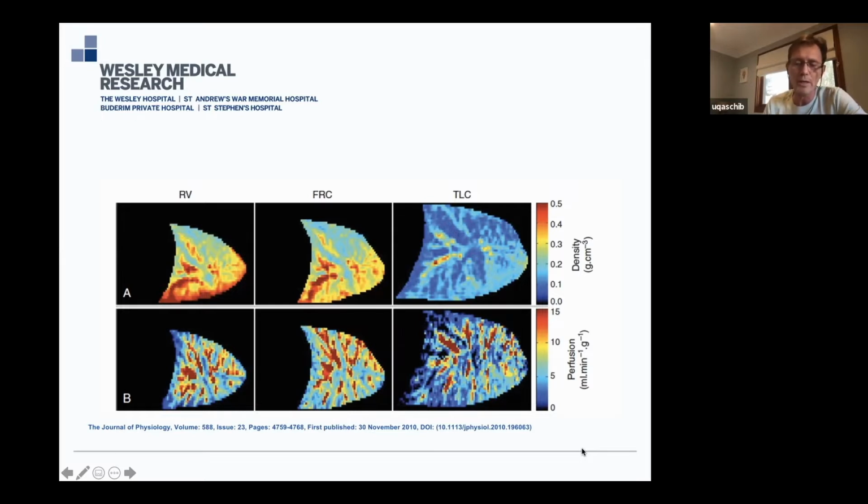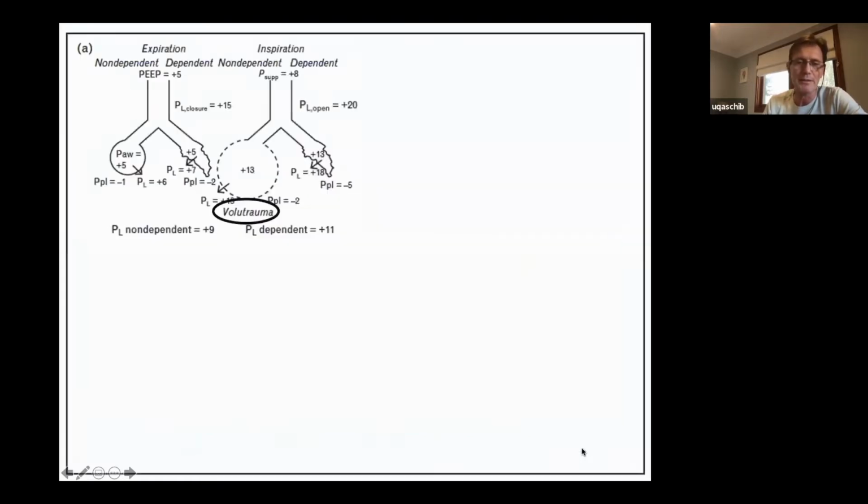Gives a lot of information diagnostically, but as I said, we can't use it bedside. Now, that leads us to how we should approach optimal ventilation. So I'm leading here first with a few slides on how optimal ventilation should be titrated in theory and how this can be measured with electrical impedance tomography bedside.